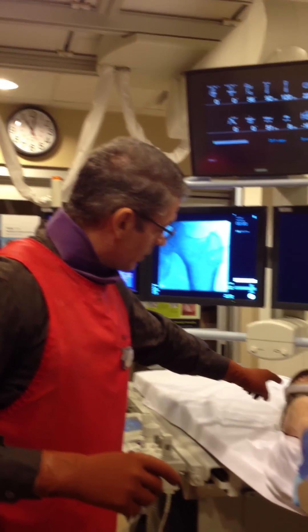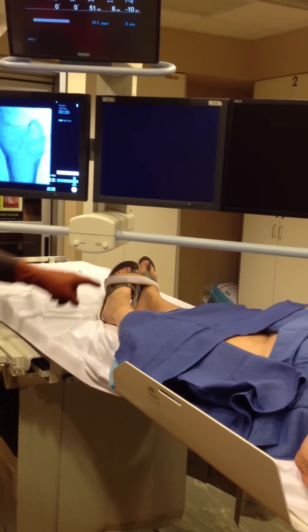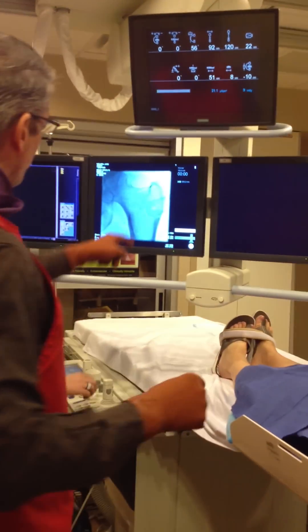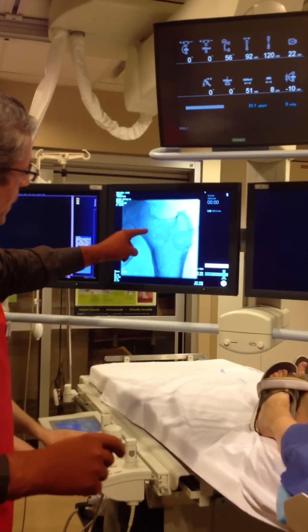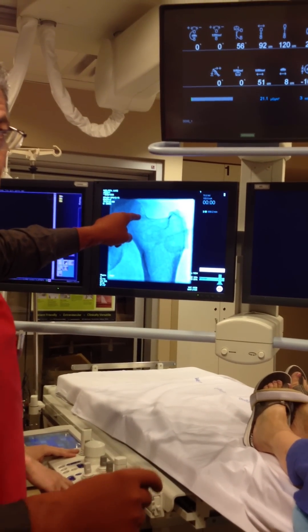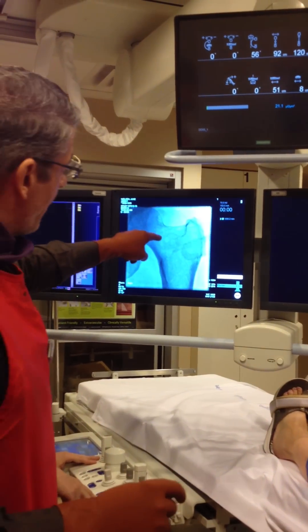First thing you have to do is try to get the feet so that the toes are in, usually a strap to help. And fluoro the hip — here's a fluoro image — so you're trying to get your needle someplace over the femoral neck, on the front of you. You don't necessarily need to go lateral unless you're having a hard time and you want to check it out.